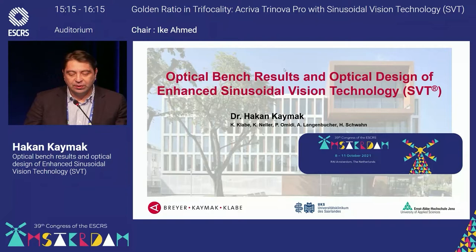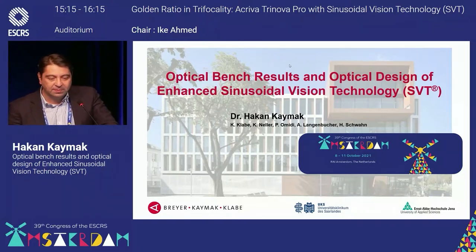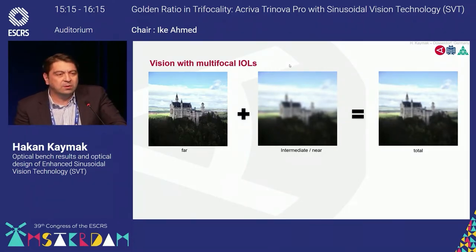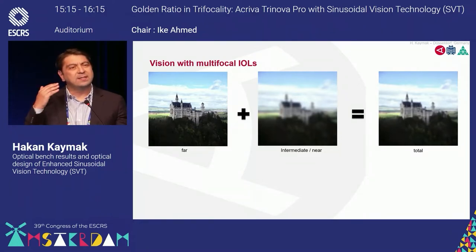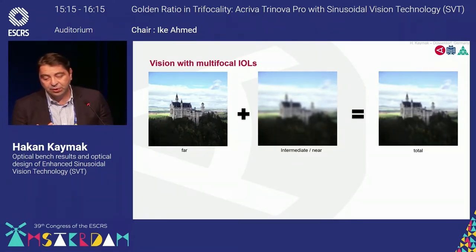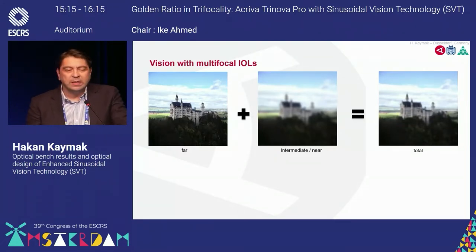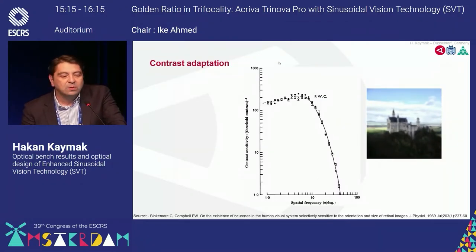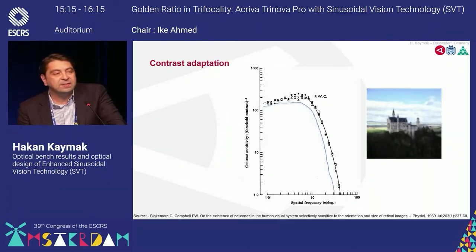Thank you very much for the possibility to talk about our optical bench results. As you know, the vision with multifocal intraocular lenses is always a simultaneous vision for the distance, the intermediate, and the near vision, and you have the total image on the focal plane of the retina, which has a little bit less contrast. But we also know that we have contrast adaptation in the eye, so that we have an increase of contrast after some weeks, so we have a perfect vision with the multifocal IOLs.